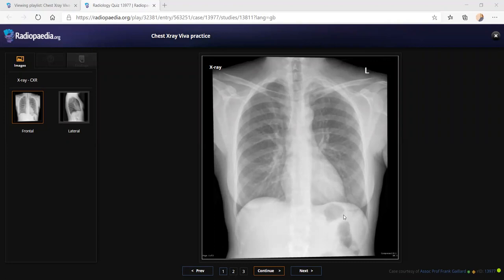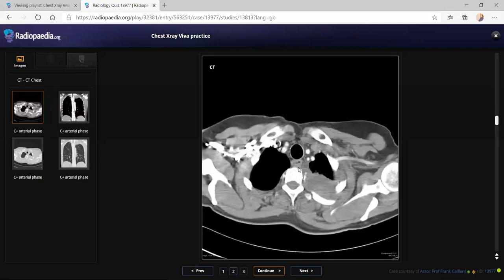The patient came with left-sided scapular pain. Okay. So, coming with left-sided scapular pain and seeing the left apical shadowing in this patient, I would be concerned that this could be a sinister lesion, which is causing neural compromise and symptoms. So in this case, I would discuss with the clinician and proceed with a contrast-enhanced CT chest or an MRI chest for further evaluation. So what will you go, MRI or CT? A contrast-enhanced CT chest, because that would be quicker.